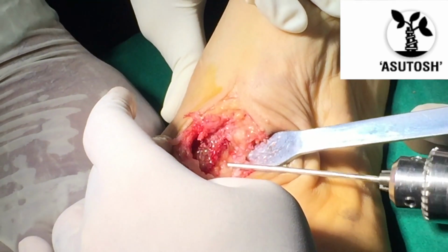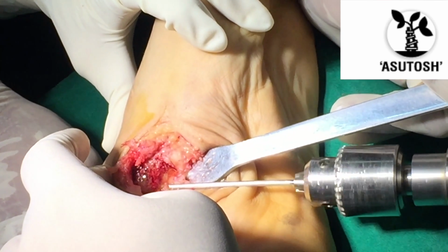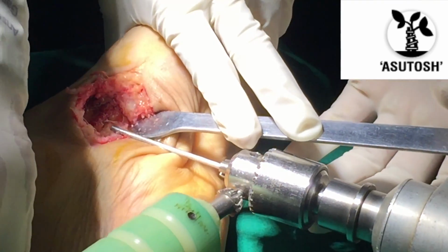Now there is a drill hole being drilled from the inferior surface of the foot into the navicular and then palpated with the finger over the dorsal surface.